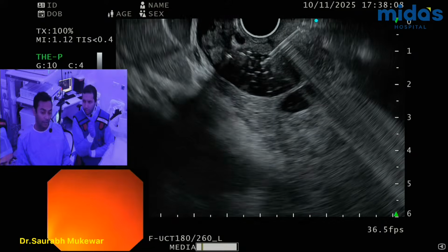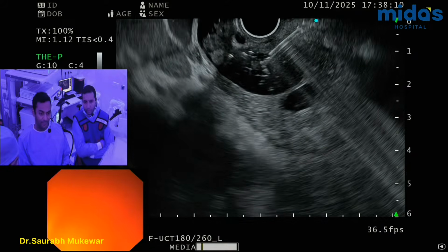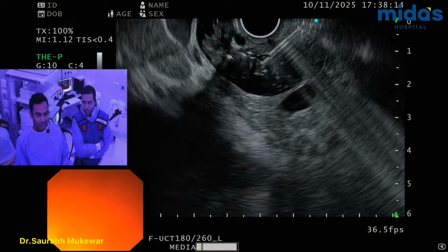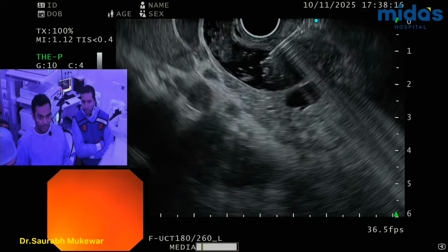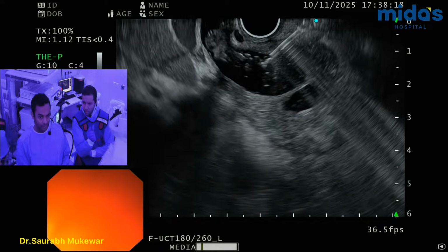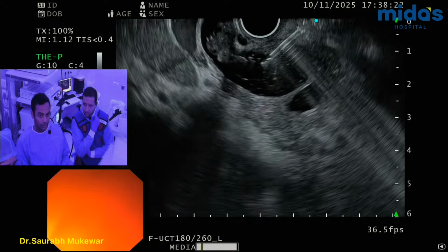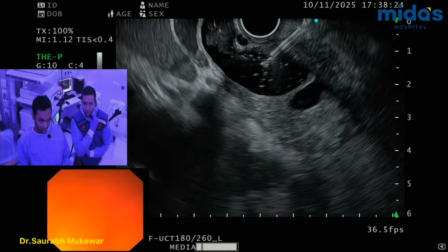The rendezvous could be done in this case, but let's see. But again, I don't like this whole exchange of wires and the shearing and stuff, so I don't like rendezvous. It's my preference. They are quite dilated. Yeah, I didn't really see it properly. I was just focused on seeing the feasibility of CDS.